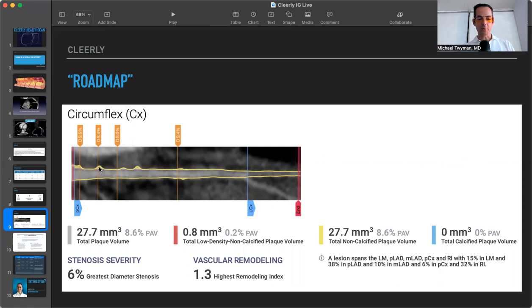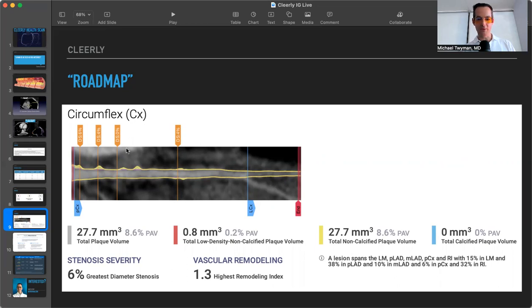So the majority of this plaque is more of this yellow-coded plaque. So it's the non-calcified plaque. There's no blue little specks that you can see here.